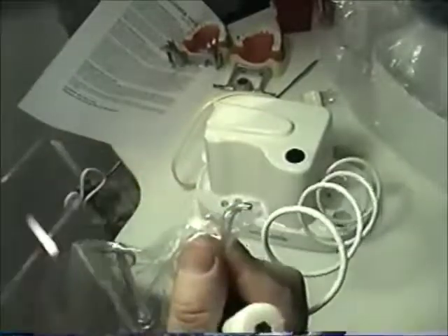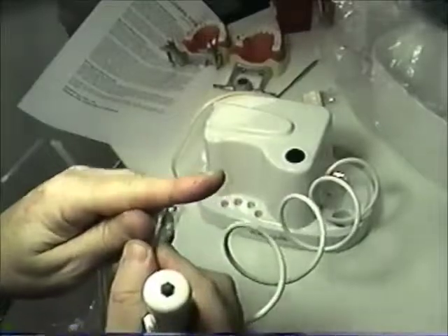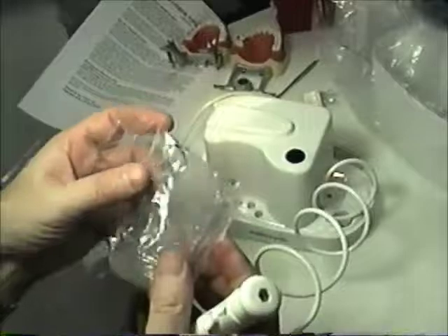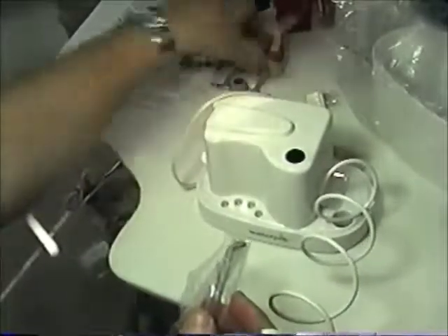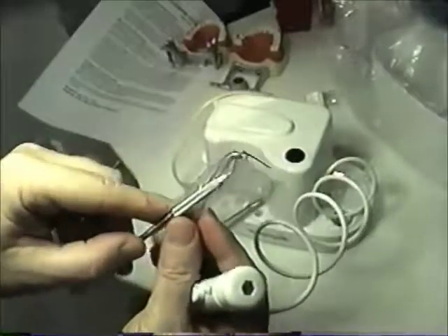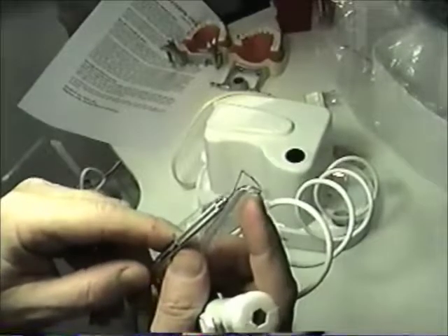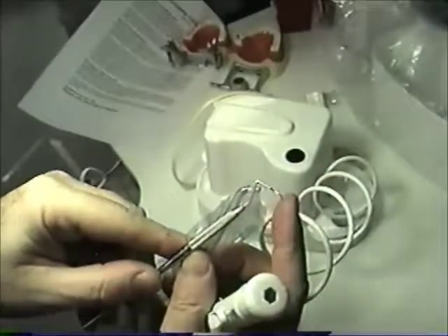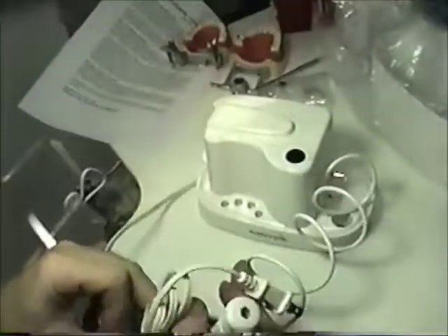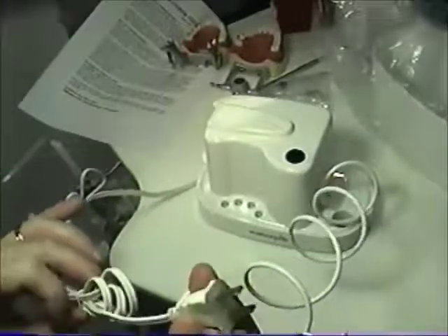Now notice this tip is way bigger than the probe that I was using earlier, but the water that shoots out of here is the same shape as that probe, so it can go up under your gum. So you're actually having an imaginary probe like this that's shooting water out. Basically you have the same thing, but I'm overlaying where the probe ends here of the water pick ends, and then the water shoots out like this probe. And you're going to shoot that up under the gums. This is electric. You want to make sure children aren't getting inside the shower or the bathtub with this, because they could get electrocuted.